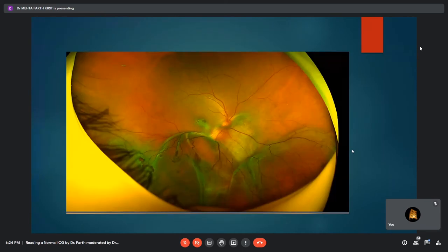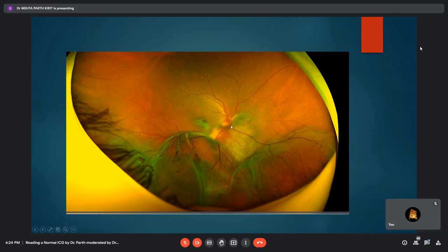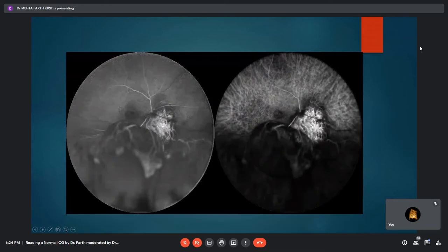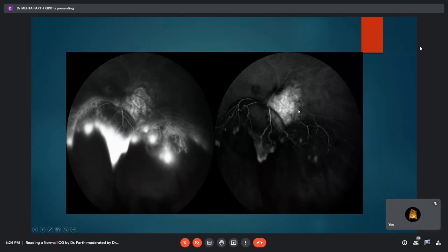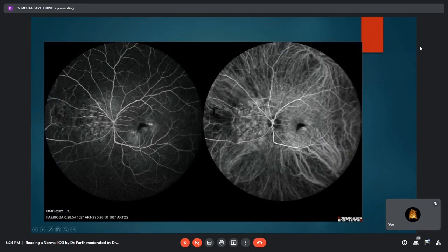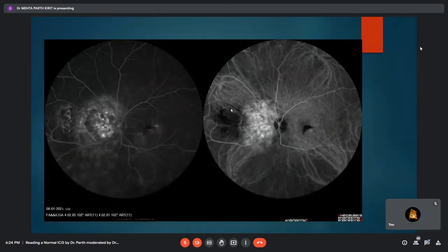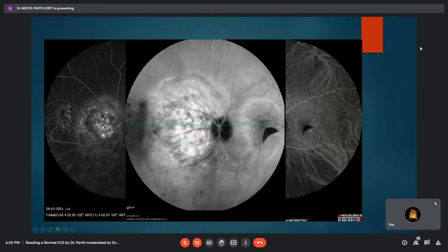An example of circumscribed choroidal hemangioma: this Optos wide-field image of the right eye shows a well-defined circumscribed lesion inferonasal to the disc, with obscured nasal disc margins and an inferior exudative retinal detachment. ICG shows characteristic brilliant hyperfluorescence in early phases with a lacy intrinsic vascular network of the tumor, and in later phases there is a washout of the dye. A second example similarly shows prominent early hyperfluorescence of the lesion nasal to the disc with relative washout in subsequent phases.